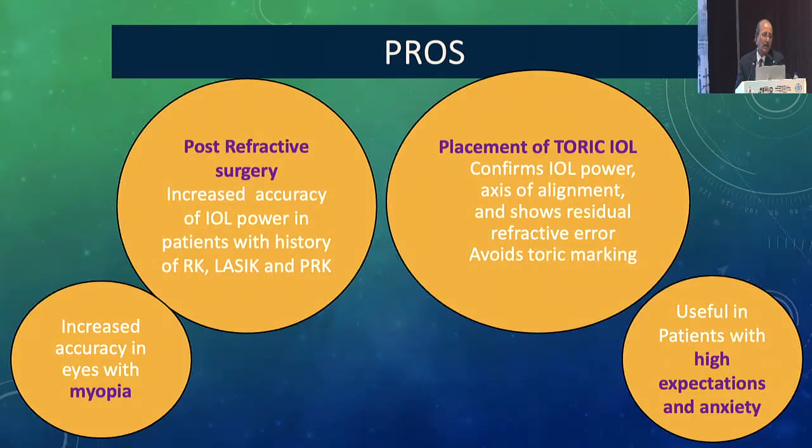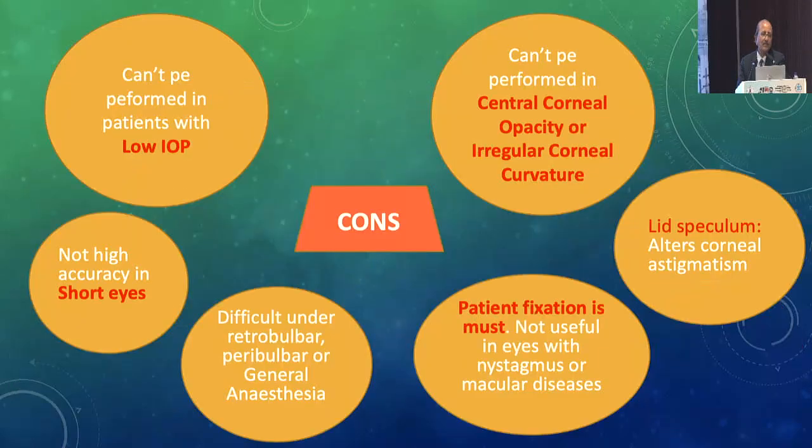Pros are increased accuracy in patients with myopia, and increased accuracy of IOL power in patients with history of RK, LASIK or PRK. It confirms the IOL power and axis alignment, shows residual refractive error, and avoids toric marking. It is useful in patients with high expectations and anxiety.